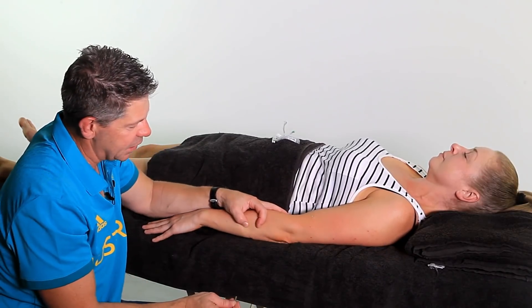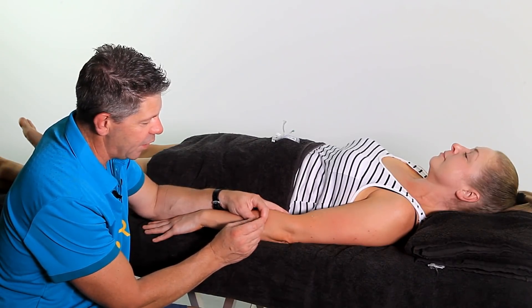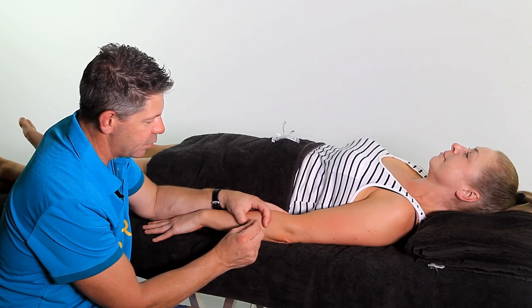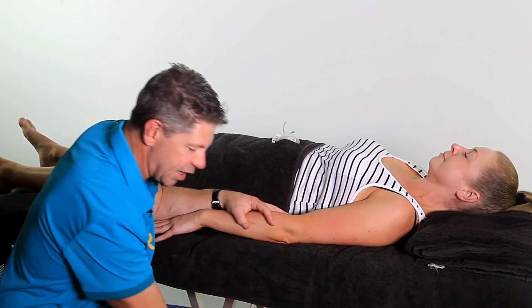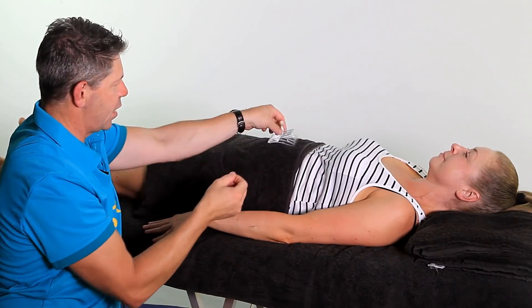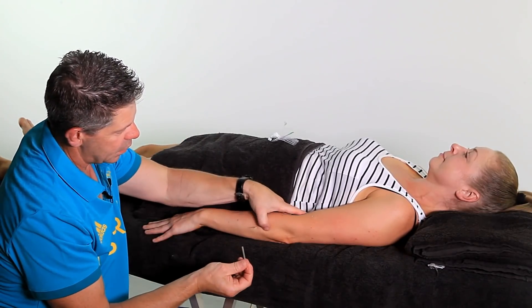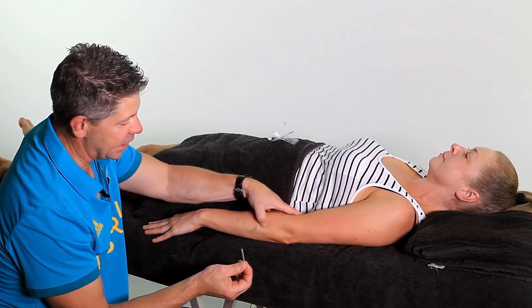Once we locate the area, I put two fingers either side of it, spread the skin so I know that's the area I'm going to place the guide over, and then just tap that in. It's just a matter of piercing through, picking up that trigger point, and then we leave it. We don't need to agitate it — if you hit the right spot, let the needle do the rest. I'm going to move a little bit further along and pick up any other associated sensitivities in that area as well.